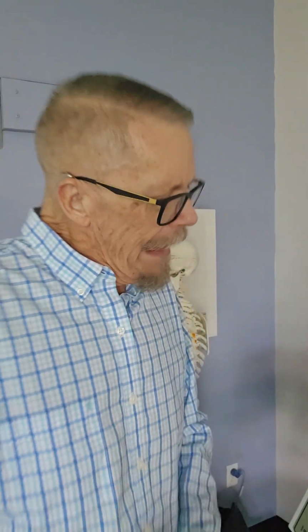It's just, stuff happens. At the moment, I don't have any people to use, so I'm gonna use a skeleton. Not ideal for what I would like to do, but let's see if it works. Mainly I'm gonna look at the axiolateral oblique, or the axiolateral mandible. So we're looking at the side of interest, which normally we're gonna do both sides.